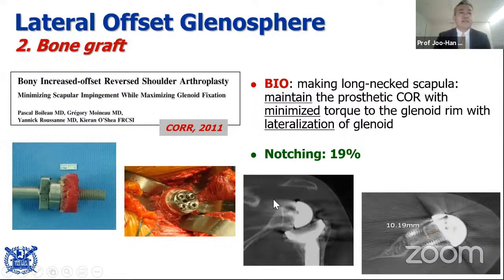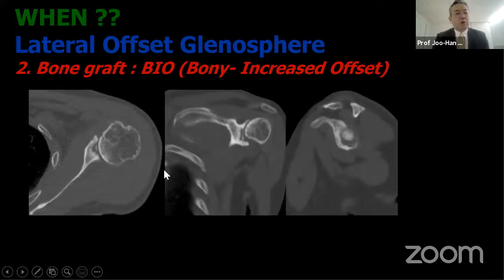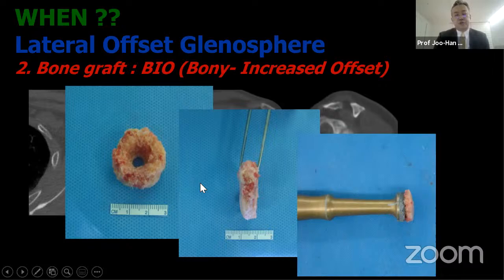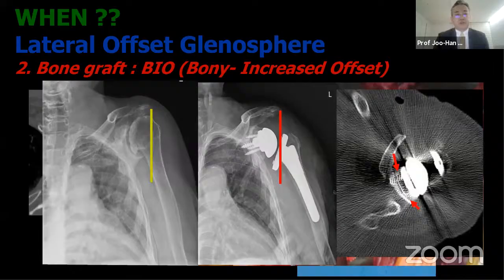The second way of glenoid lateralization is bone graft. As you know, one centimeter of bone graft makes a longer scapular neck. So I like to use bone graft in patients with bone deficiency in the glenoid. One to 1.3 centimeters of bone graft can be put on the native glenoid, and we can get more lateralization of the center of rotation.